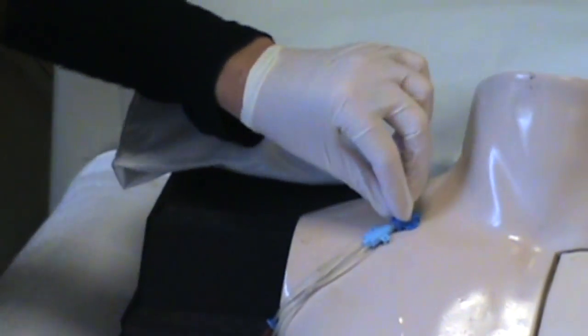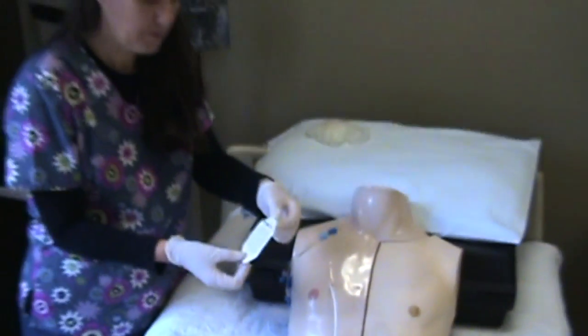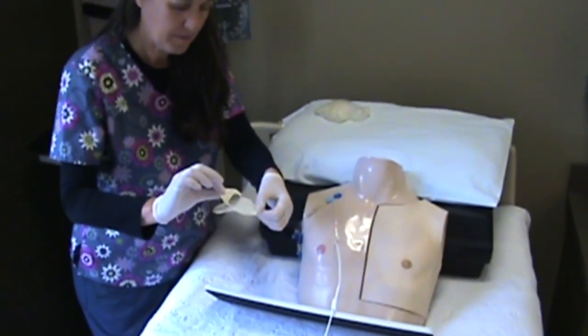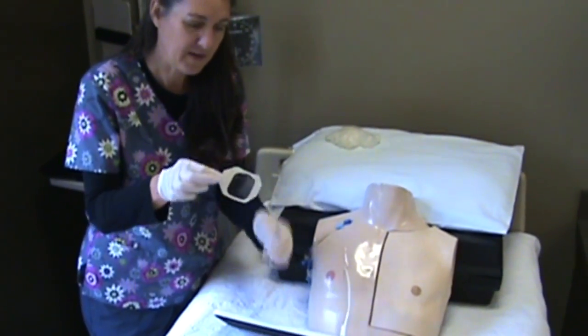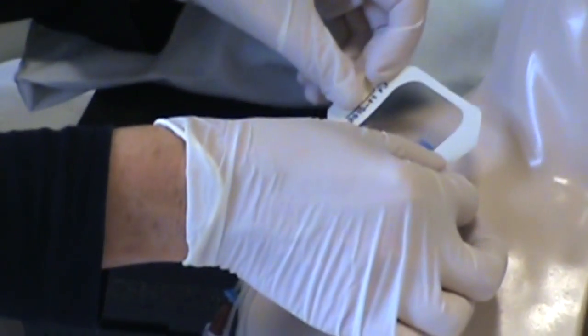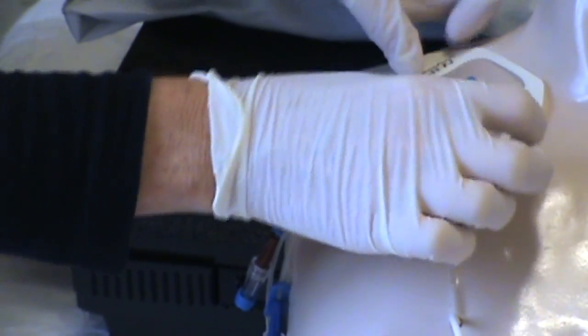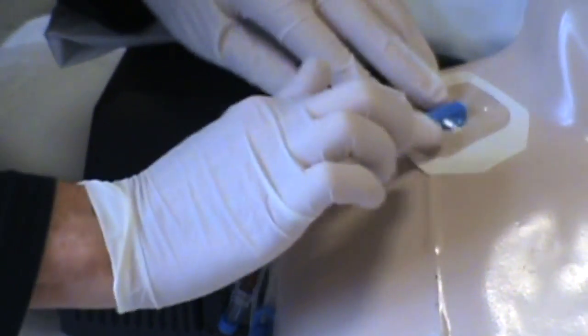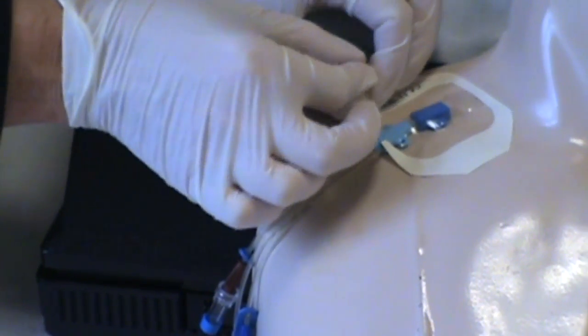For your tegaderm, when you put that on, you'll just take the back off like the back of a band-aid, and you'll just put it right over. Put it down nicely and then peel off the edges.